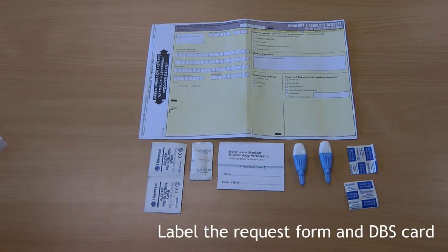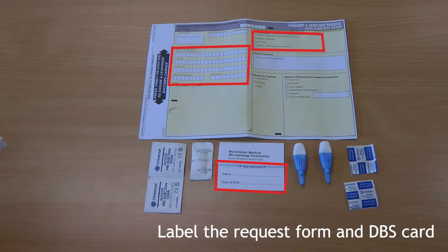Firstly, fill out the request form, providing as many of the patient's identifiers as you have available, and enter the patient's name and date of birth on the blood collection card. This is important to ensure we can test the patient sample and report the results back to you.